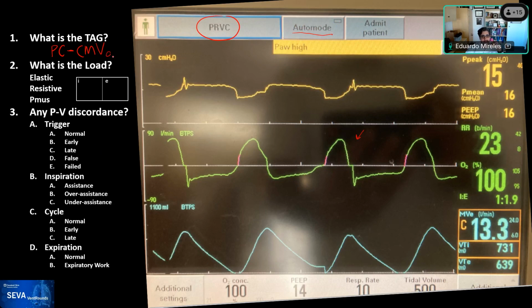And then the final statement is adaptive, and this is adaptive targeting, and this was well recognized by the team. We spoke a little bit about adaptive targeting before, but just remember that in adaptive targeting, you set a tidal volume, which you can see down here. But that is not that you're controlling the tidal volume. You are telling the machine a target for tidal volume. And in this case, it's 500. And immediately, if your eyes come and look at the tidal volume that is inhaled and exhaled, you rapidly recognize that the tidal volume is not 500, that the patient is inhaling and exhaling more than 500.